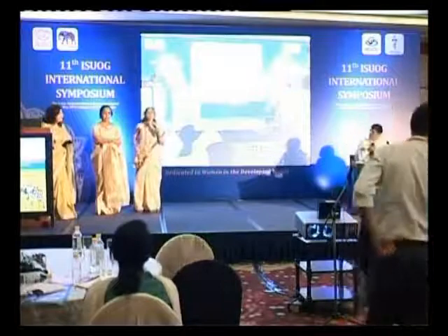Sure, you may call it a HyCoSy, you may call it a HyFoSy. It's HyFoSy, it's foam. Foam, I know, but when we are using this also, we are creating a foam inside. No, but then the availability. The contrast is different. But basically the procedure is just the same. It's more cost effective. Yeah, sure.